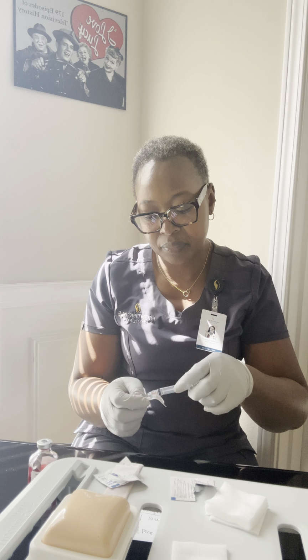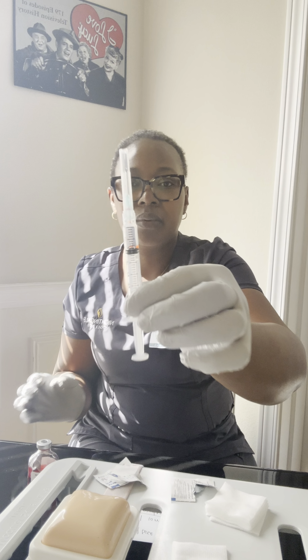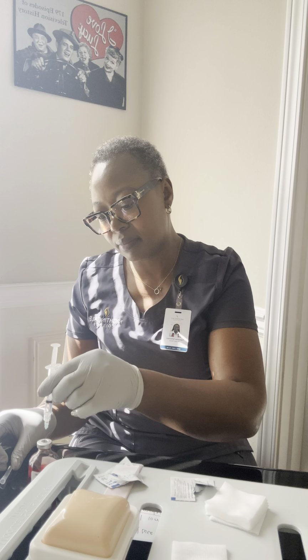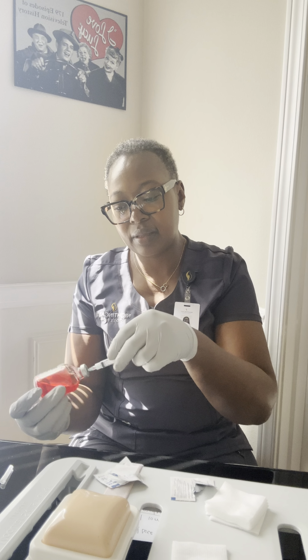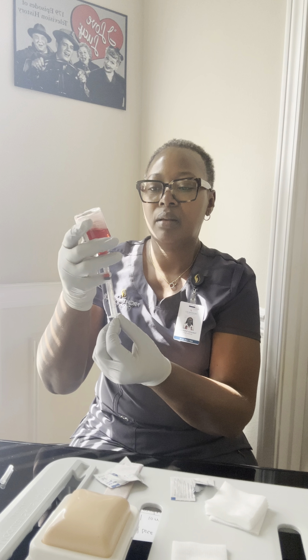I will then go ahead and draw air into my syringe. In this case, I'll be working with 1 ml of air, because that's the volume of medication that I intend to draw. So 1 ml of air, and I'll go ahead and inject the air into the vial. I will inject all the air in the syringe. I'll then go ahead and invert the vial to be able to draw the medication. I'll be drawing 1 ml.